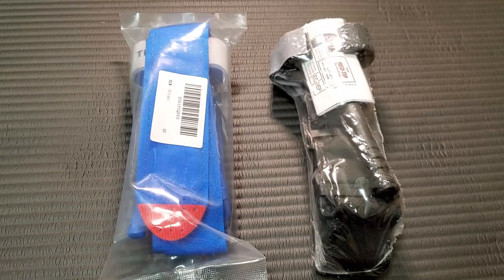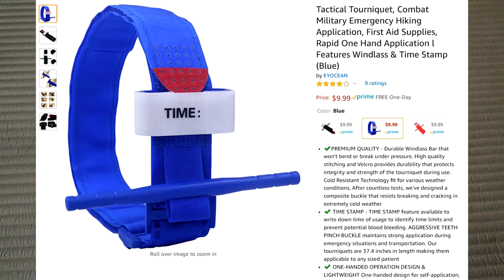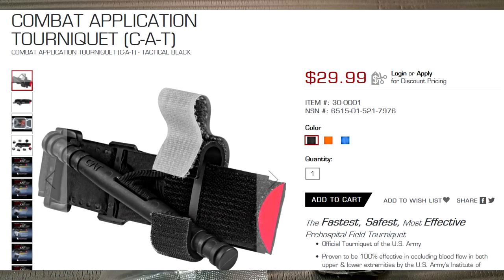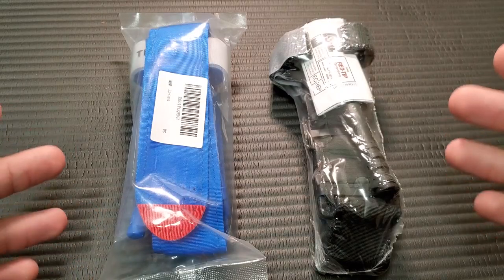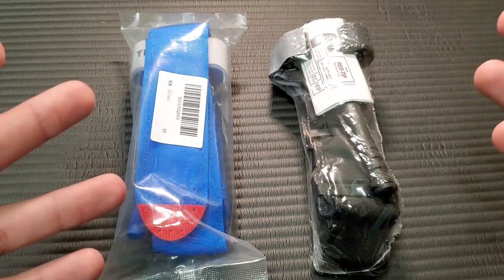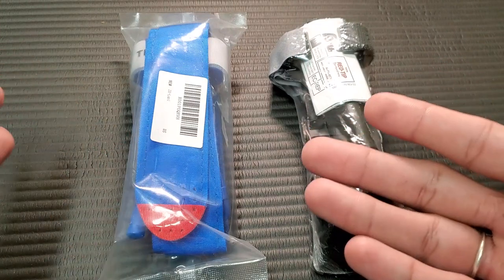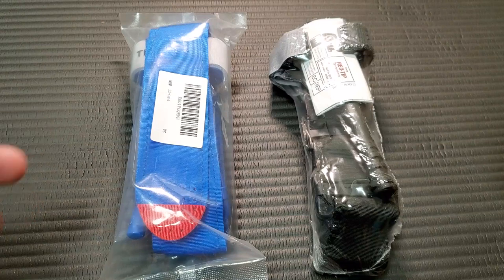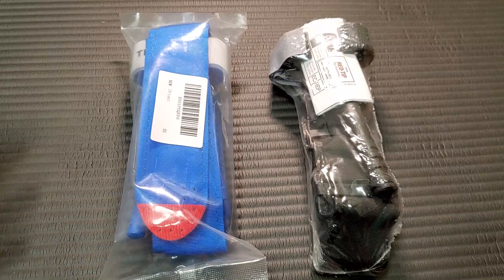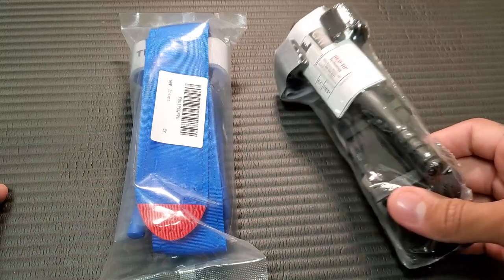Right off the bat, let's go over the pricing. This tourniquet I was able to purchase for $10 off Amazon. The CAT tourniquet you can usually get for about $30 to $35. That's not a huge difference. However, for something like a tourniquet — it's something you don't really intend to use, you hope you never use — so they might go the cheap route. I would disagree with that mentality, but that is a reasoning behind going with something cheaper as opposed to the actual CAT.